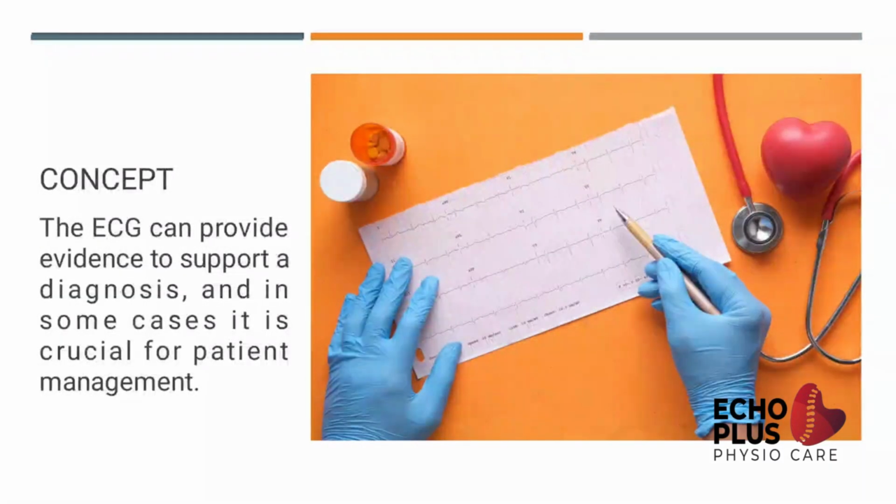So before that, what is the concept of ECG? It is not a tool for diagnosis, but it is a supporting tool for your diagnosis. Having said that, the major part of your assessment and diagnosis will be your history and physical examination of the patient.